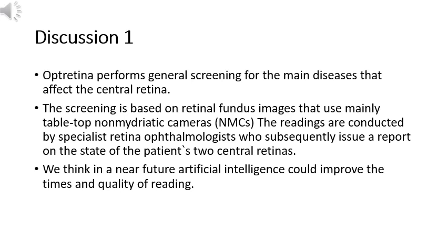Since the screening is based on retinal fundus images, we consider the first 3 algorithms to be useful when the photographer, optometrist, general practitioner, or technician uploads the images on the telemedicine platform. In this way, the system can detect that there is at least one retinal fundus image for each eye and that the image is of a good enough quality to be evaluated.